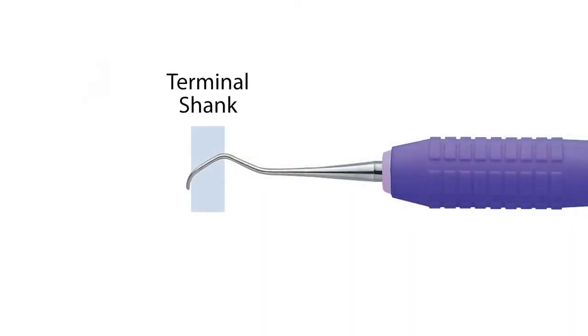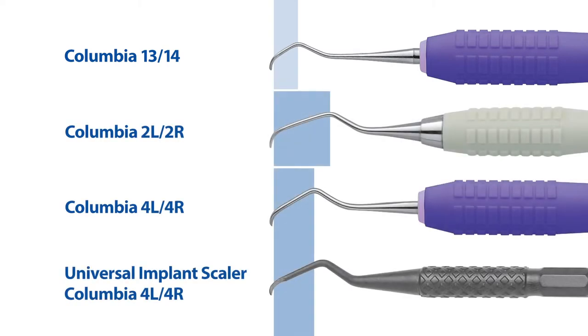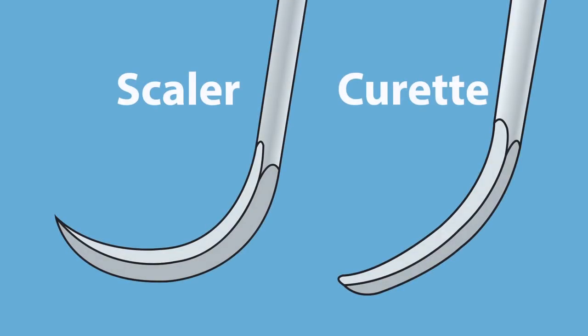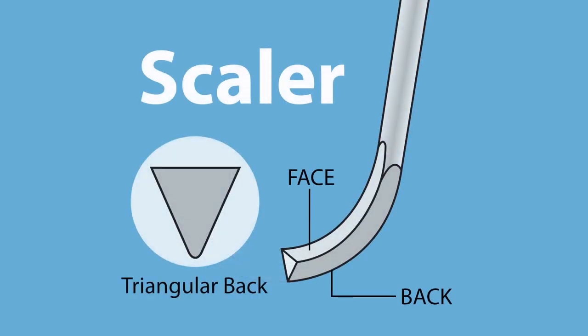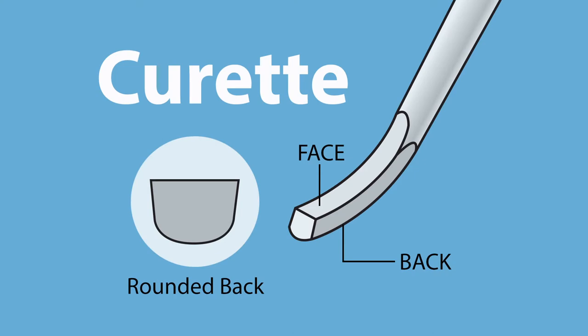The terminal shank is the lowest section of the overall shank, which is closest to the working toe. The Columbia 1314 Curette has a shorter terminal shank when compared to the additional designs of the Columbia series. When comparing the differences between a scaler and a curette, you will find that the scaler has a pointed tip and triangular back to the working end, whereby the curette displays a rounded toe and smooth rounded back to its working end.